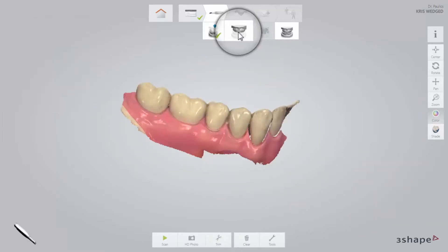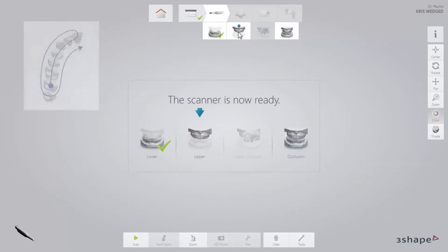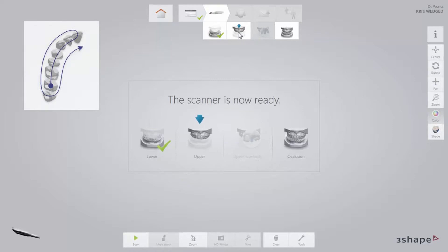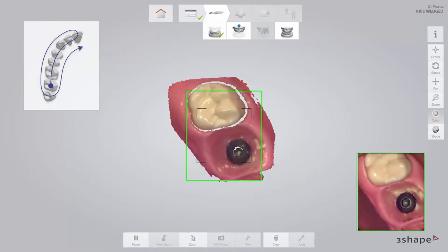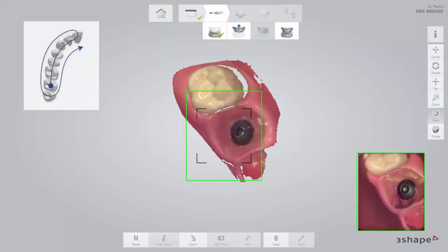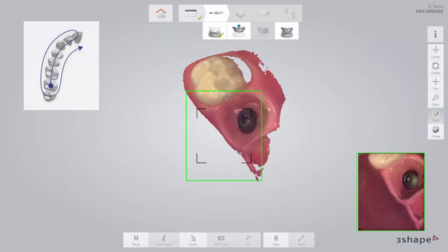Now proceed to the upper arch. Firstly, scan the same area as in the lower arch with the healing caps in place.